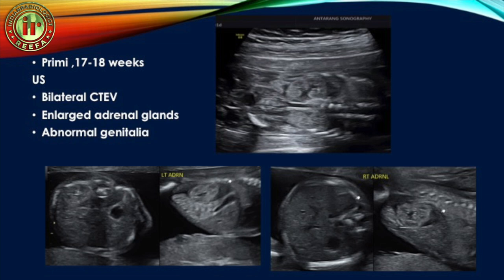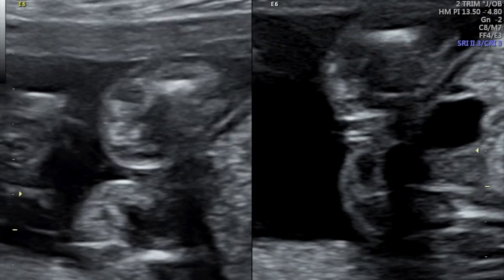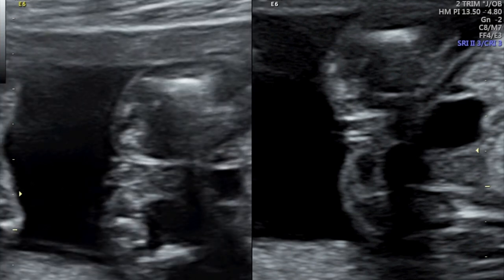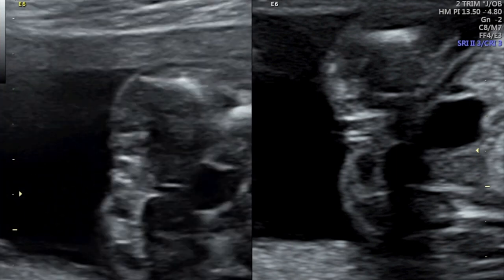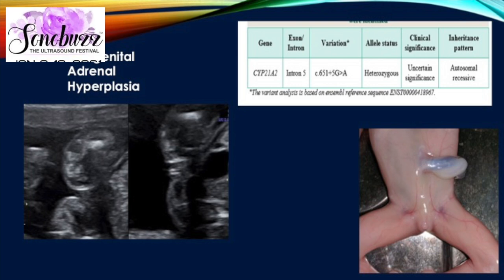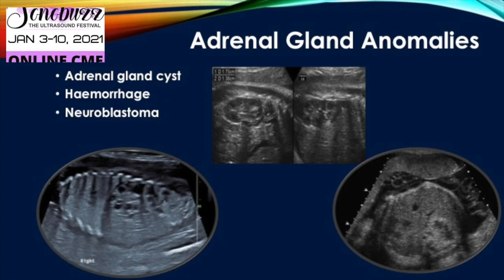Here is a case presenting between 17–18 weeks. Ultrasound findings showed bilateral enlarged adrenal glands and abnormal genitalia. You can see hypoechoic triangular areas just above the kidneys, with length nearly half that of the kidneys. The still images show enlarged left and right adrenal glands. On the perineal clip, you can see the labia with a protrusion in between. A diagnosis of congenital adrenal hyperplasia was suspected. The pregnancy was terminated, and the abortus confirmed abnormal genitalia. The mother's genetic report later showed a CYP21A2 gene mutation associated with CAH, though of uncertain clinical significance.